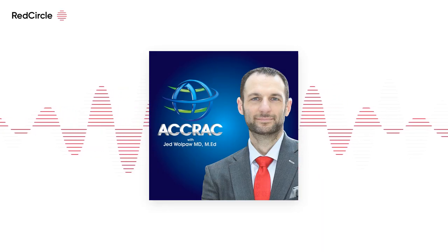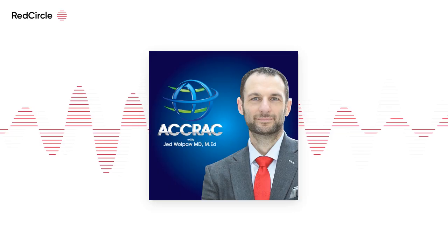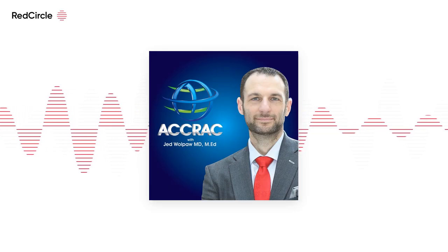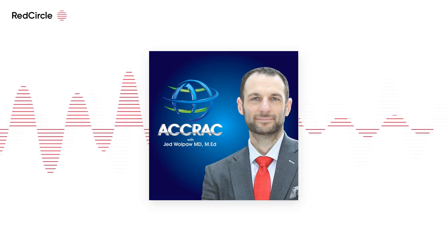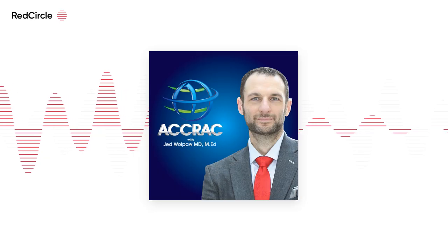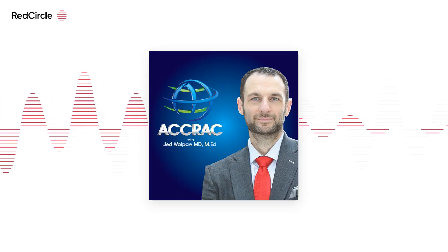And when we are doing this trial and we're coming down, we are looking at compliance and also driving pressure, which you brought up before, Tom. So do we need to look at both? Can we just look at driving pressure, which is quite easy to calculate, as you said, by just doing plateau pressure minus PEEP and seeing where we minimize driving pressure? Or do we need to look at both compliance and driving pressure? How does that work? I think it depends on which method you're using.